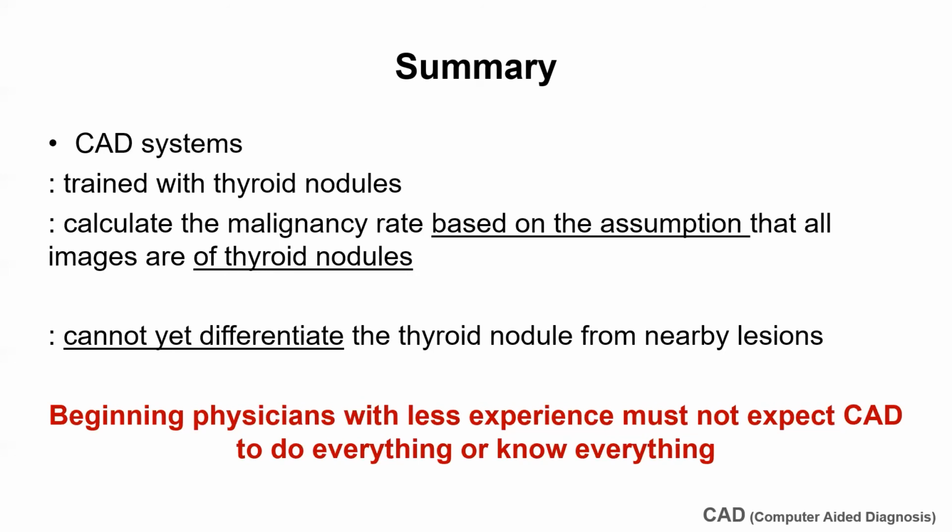Ultrasound performers need to have a deep understanding of normal thyroid adjacent structures and ultrasound physics, as no machine can yet completely replace the humans who perform ultrasound.